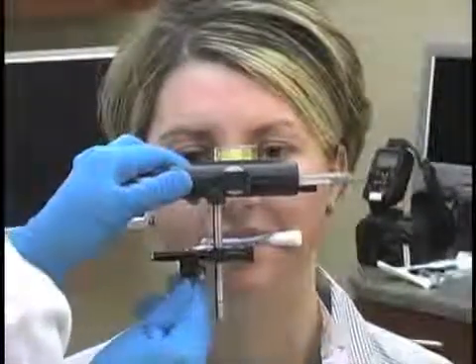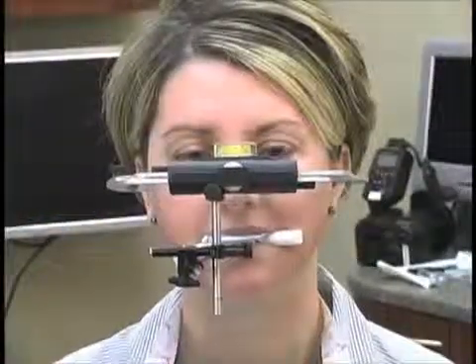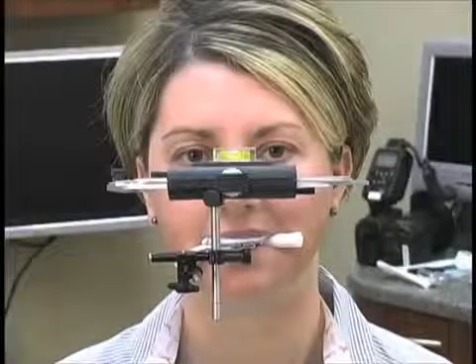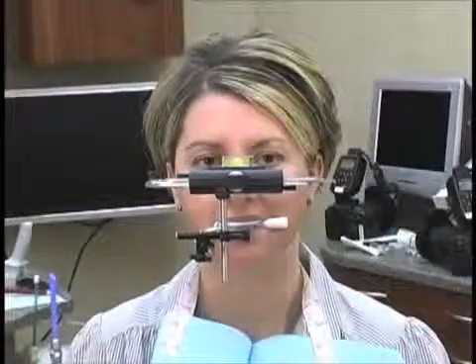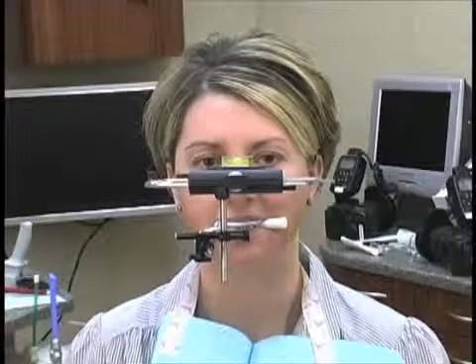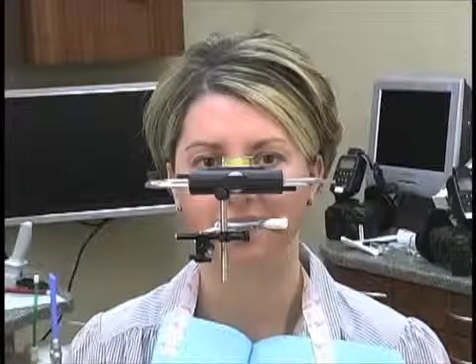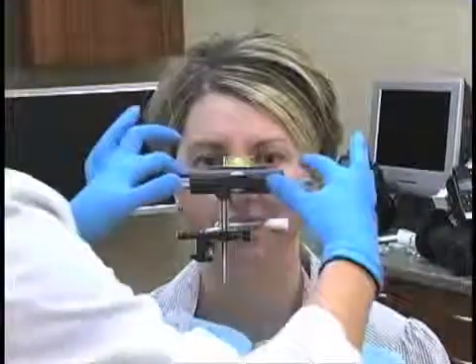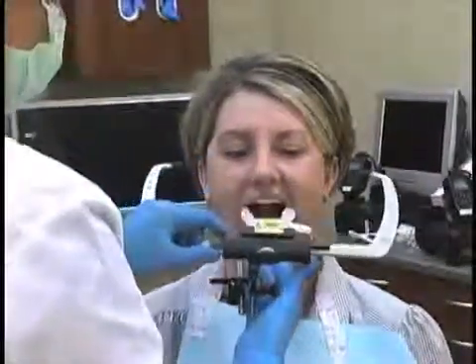Now what we've just accomplished there is taken this Facebow so that it's going to be properly centered on the articulator vertically, and we've now just paralleled that Facebow so it'll be directly parallel with the top of that articulator. And again, the key point here is any cants that exist in this patient will be seen on this articulator. That maxillary cast is going to be hanging on that instrument exactly how the maxilla is hanging in the patient's head. Okay, so at this point, all we have to do is just loosen up that Facebow. Patient opens up, and we're done.